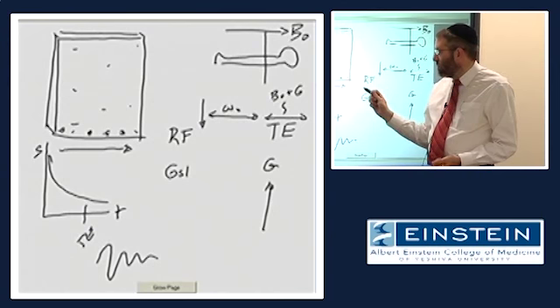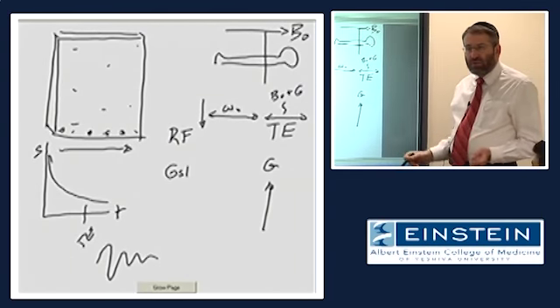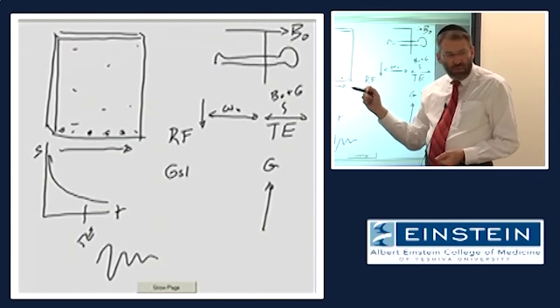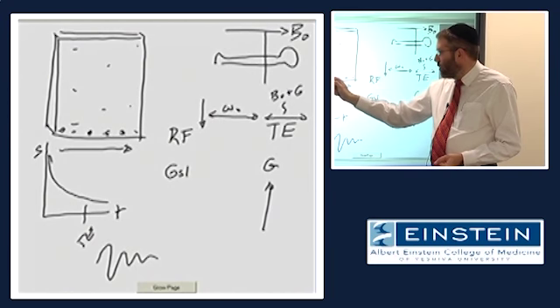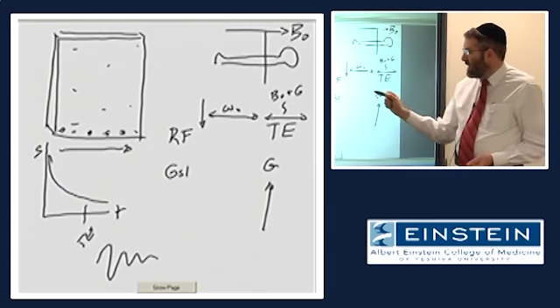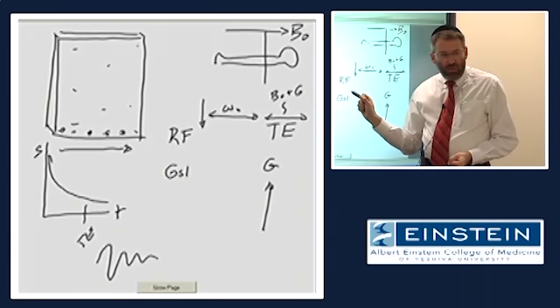If there's heart and lung and liver, those all have different amounts of signal amplitude. And all we're trying to do is to put it in the right place. So the reality is that there are different components of signal amplitude, and each of those amplitudes has a unique frequency depending on the location from left to right.